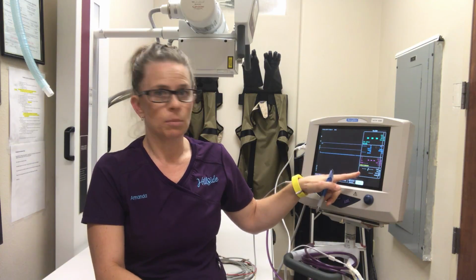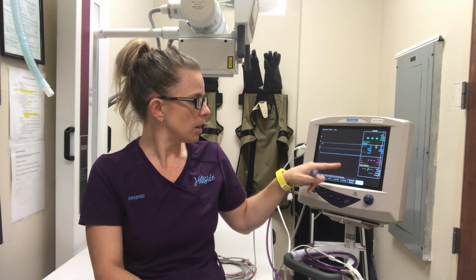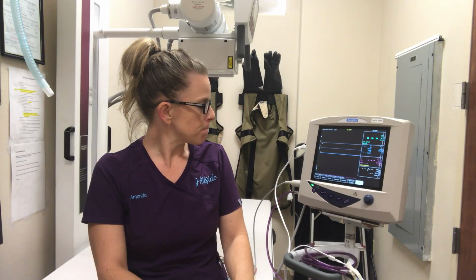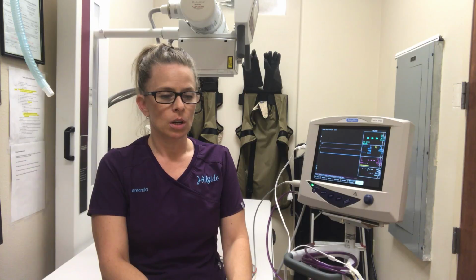This also records the blood pressure, so you want to monitor blood pressure. This will do systolic, diastolic, and mean, which is kind of nice to have all of those readings, so you really know what their actual blood pressure is like. And obviously we don't want any of our patients to become hypotensive or hypertensive. There are ways of combating that, but you certainly want to stay on top of it, so that hopefully none of those things happen.